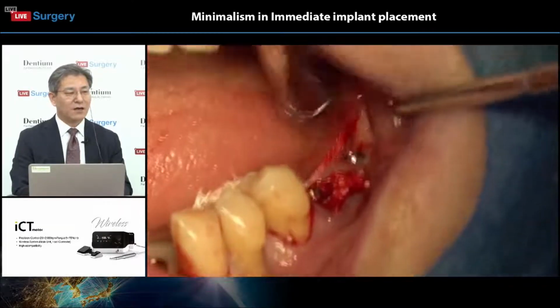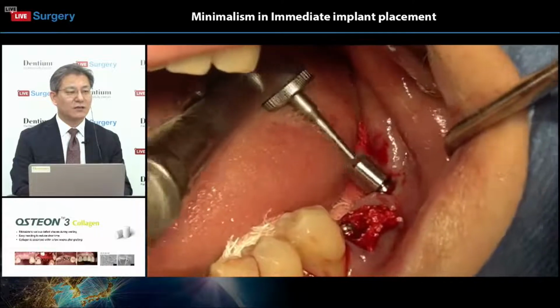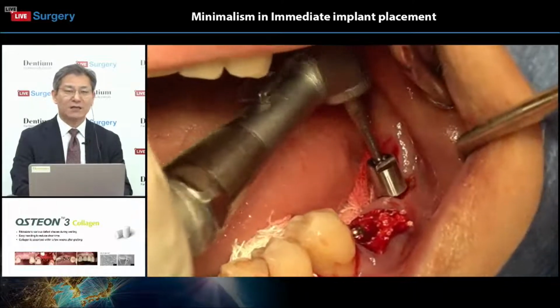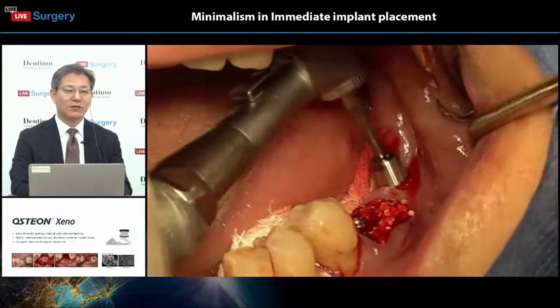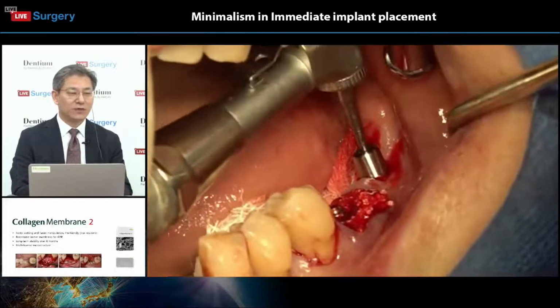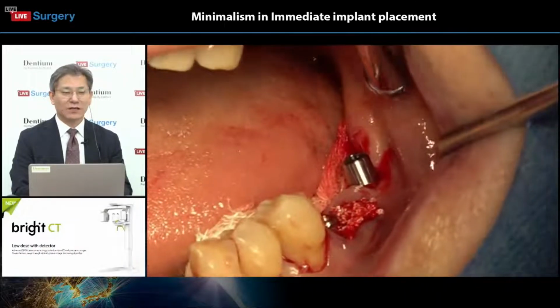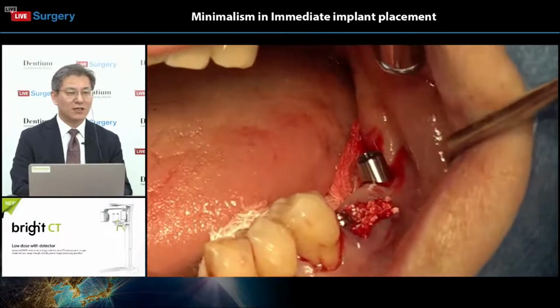And I think connect with the healing cap. Actually, the official name is comfort cap. Comfort cap, official name, comfort cap. Dual function, the promoting healing, and also the scanning jig.